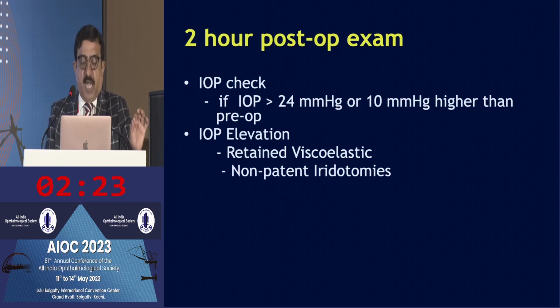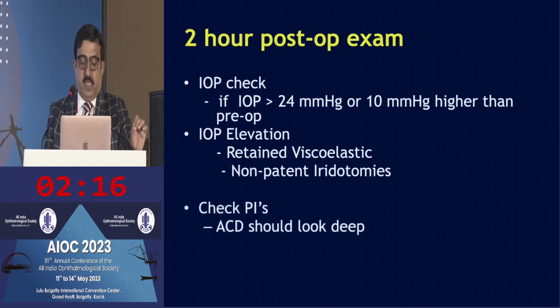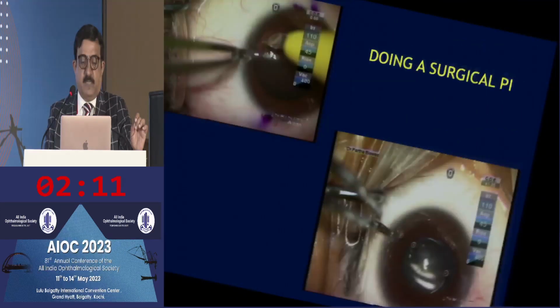What about iridotomies or iridectomies? We do not do iridectomies as of now, except if it is a hyperopic ICL. And of course, the PI should be checked if it is required.